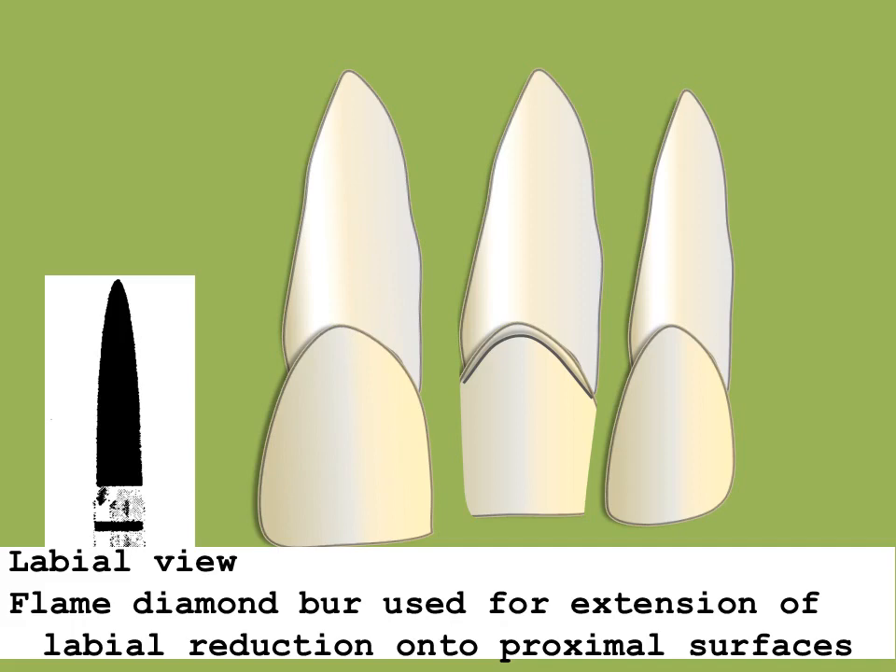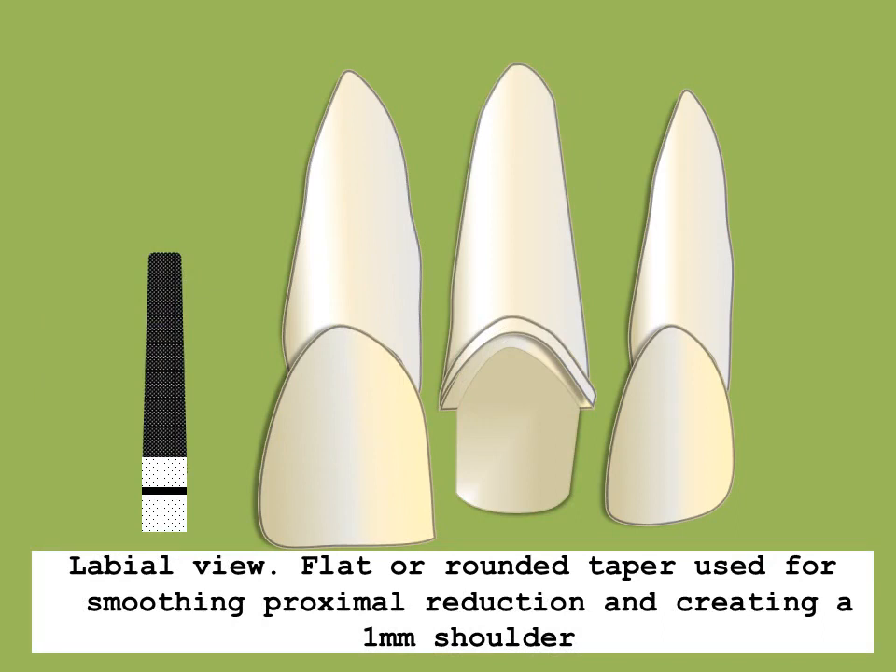You know the old adage — measure twice and cut once. Using a labial approach, the flame-shaped burr is used to access the proximal. When sufficient space has been created, the 6847-type burr, once again held parallel to the long axis of the tooth, is used to form the shoulder and create the necessary taper. It is crucial to avoid over-tapering in the preparation. The burr, when used correctly, will establish the shoulder and correct taper of the axial wall. Better results will be obtained using a gentle sweeping motion with light pressure. Light pressure with copious water spray should be employed. Worn or damaged diamond burrs should not be used. Sharp line angles should be rounded.